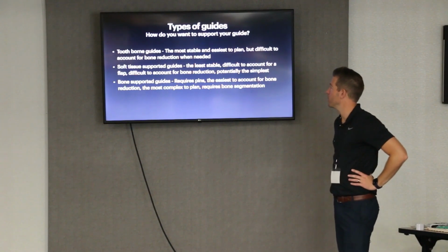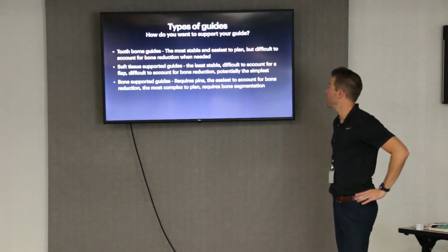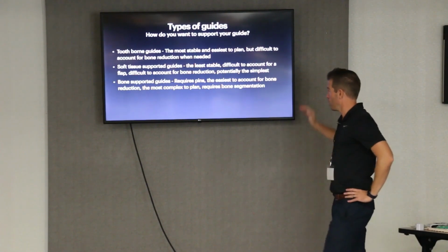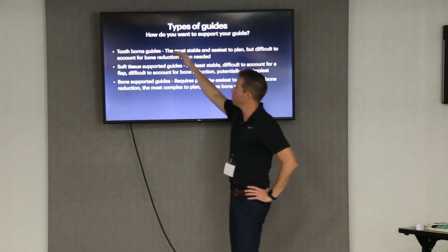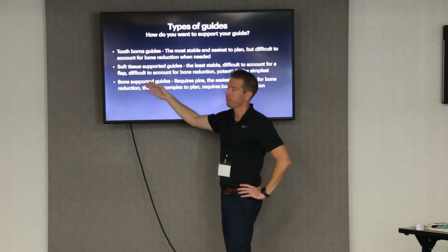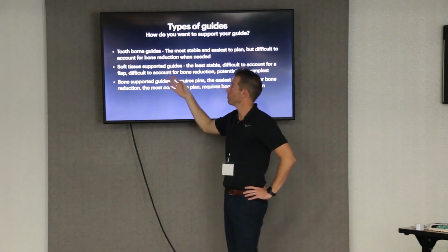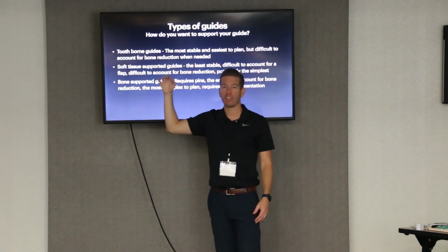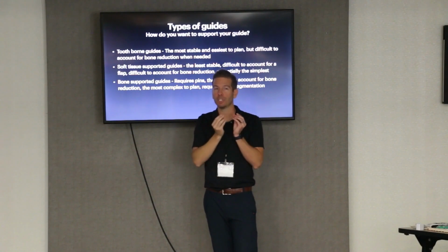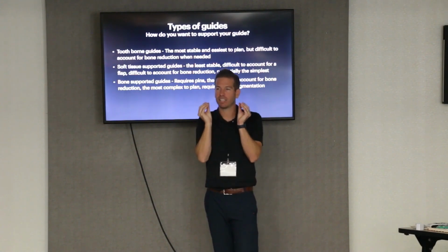Here are the three types of surgical guides. So you've got a tooth-borne guide, a soft tissue guide, and a bone-supported guide. So tooth-borne guide, think about what we're doing every day with the simple single surgical guides. You're snapping a guide onto teeth.